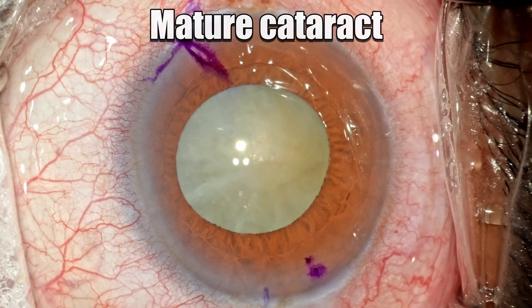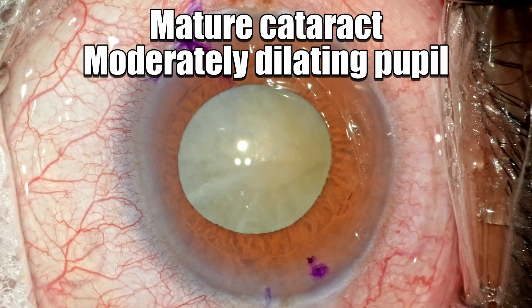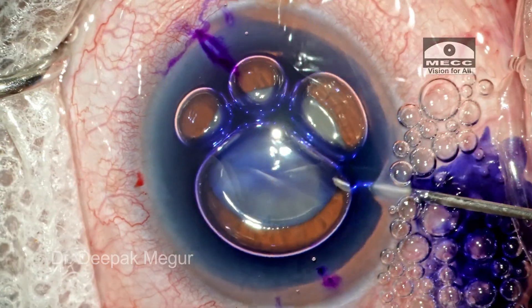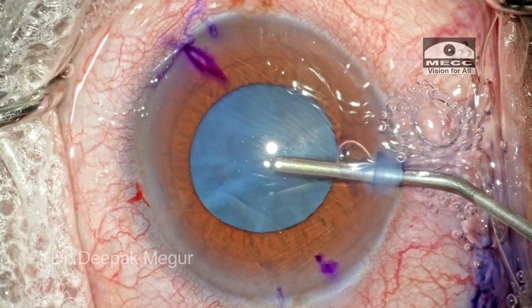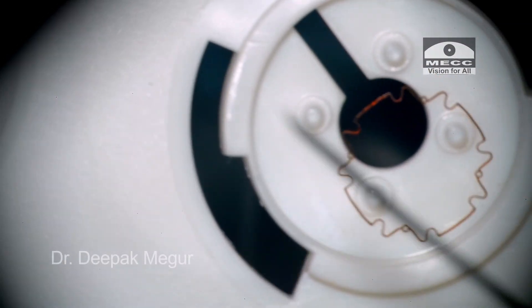This is a 70-year-old man who has a mature cataract with a moderately dilating pupil. The capsule is stained with trypan blue and the chamber is filled with OVD — time to insert the B-Octa device.